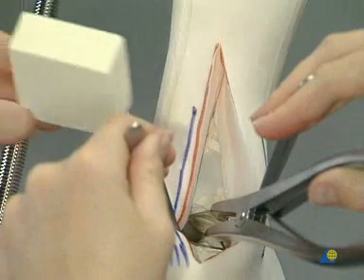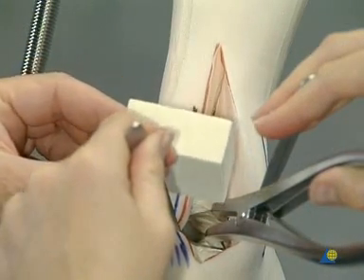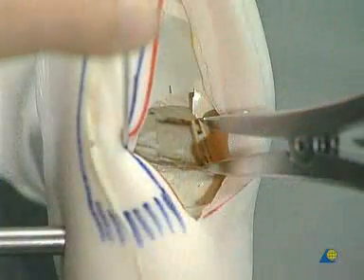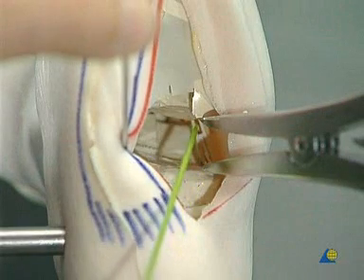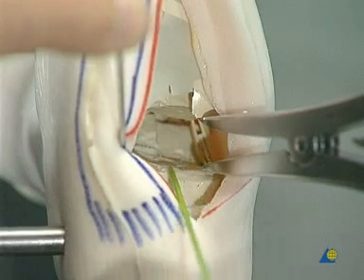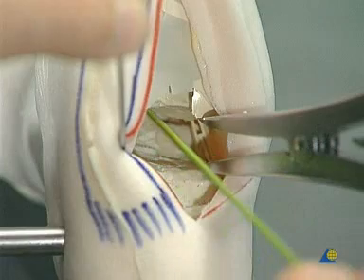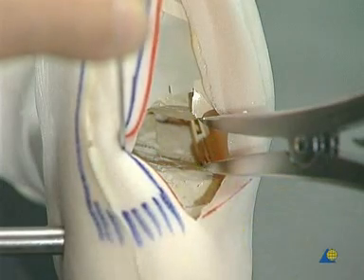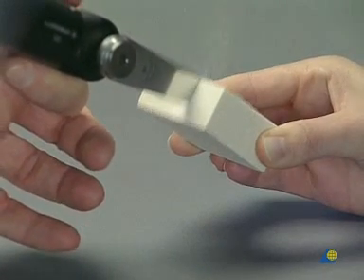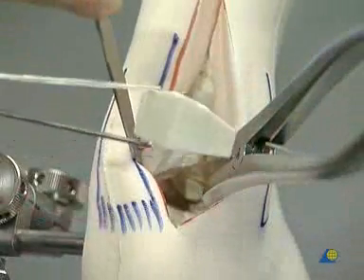A tricortical bone block is used, harvested from the posterior pelvic crest at the level of the sacroiliac joint. The definitive measurements are taken for the bone block to be interpositioned. The block is trimmed using the oscillating saw, resulting in a trapezoid shape.